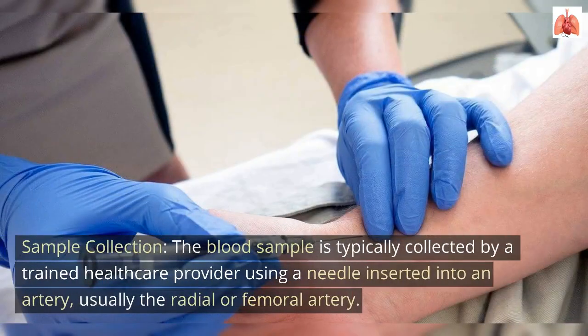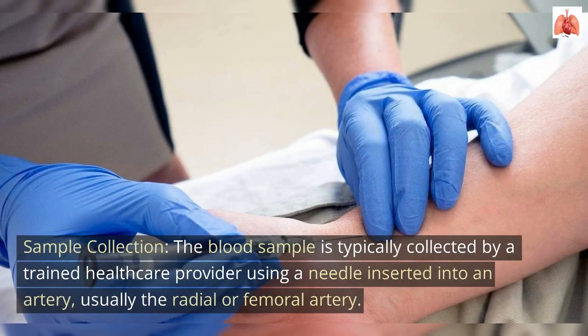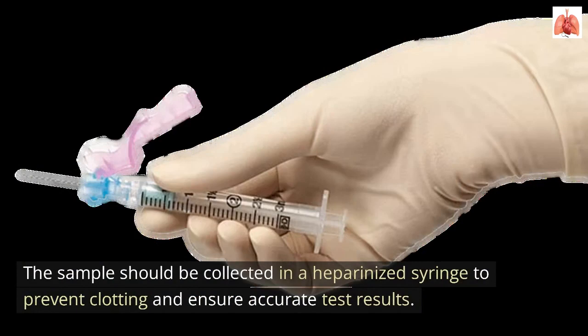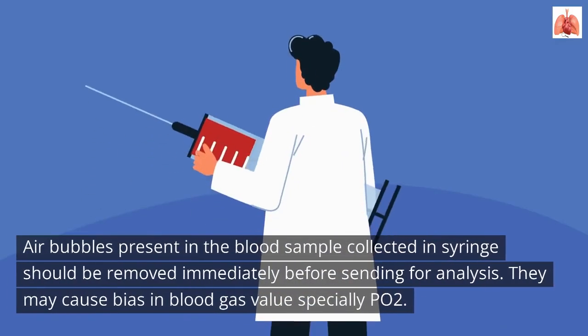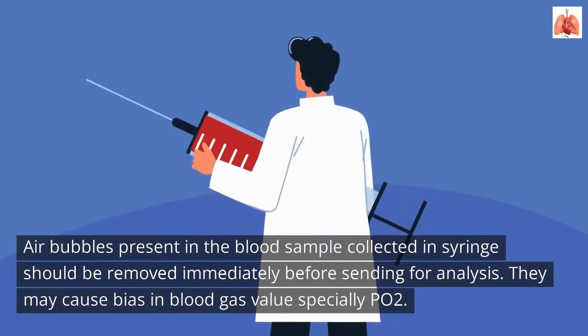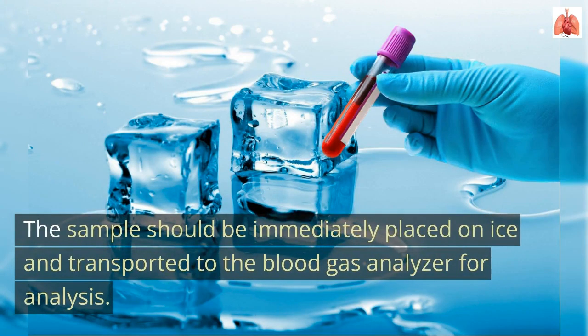Sample collection. The blood sample is typically collected by a trained healthcare provider using a needle inserted into an artery, usually the radial or femoral artery. The sample should be collected in a heparinized syringe to prevent clotting and ensure accurate test results. Air bubbles present in the blood sample collected in the syringe should be removed immediately before sending for analysis. They may cause bias in blood gas values, especially PO2. The sample should be immediately placed on ice and transported to the blood gas analyzer for analysis.